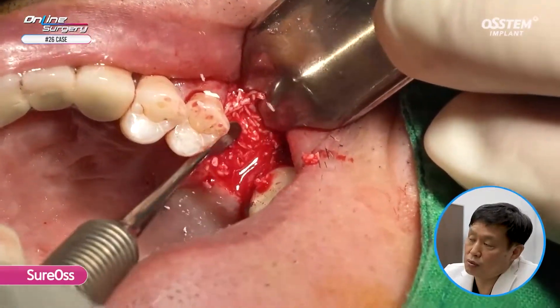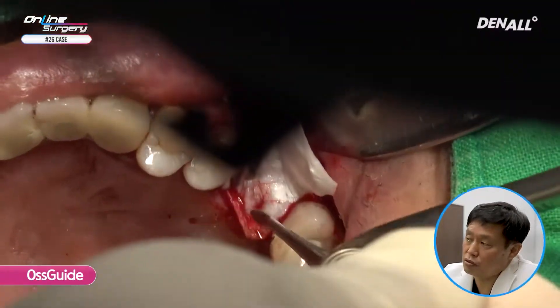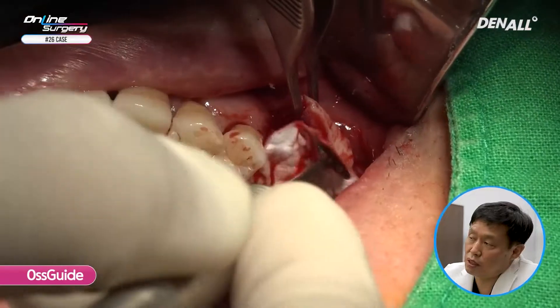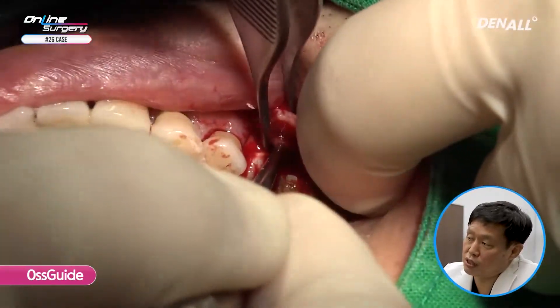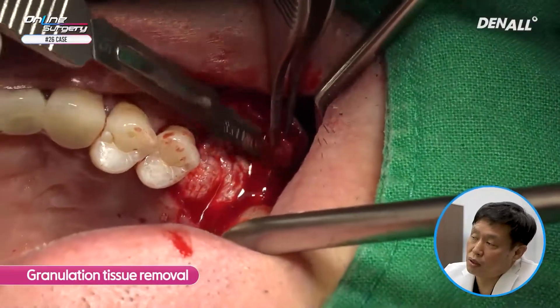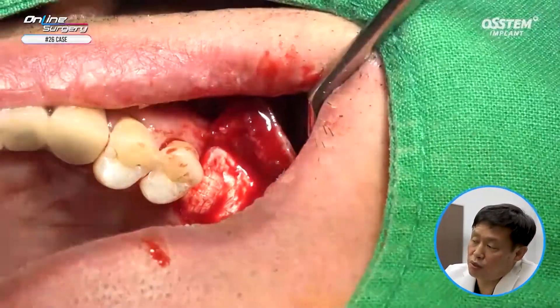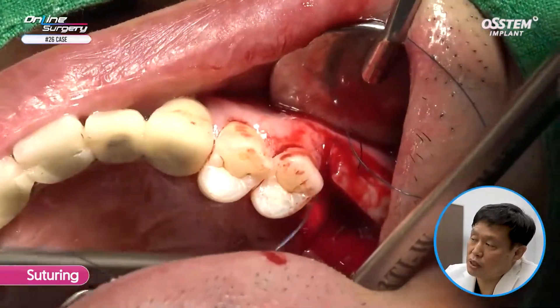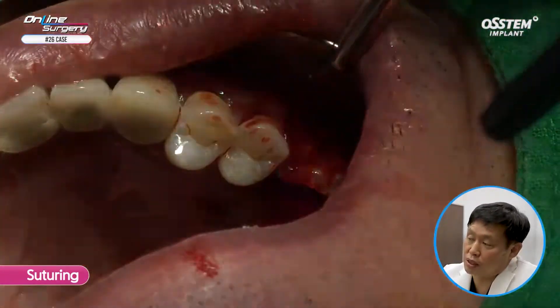Bone graft is done up to the implant top. Soft tissue was not fully healed after implant fracture, so in order to get full recovery, I will use one layer of collagen membrane. I then repositioned the flap. As I removed the implant, there was granulation tissue — I removed it, and after that, suture was done. Interrupted suture was done once on the mesial and distal sides, and in the middle I completed using a figure-of-eight suture.